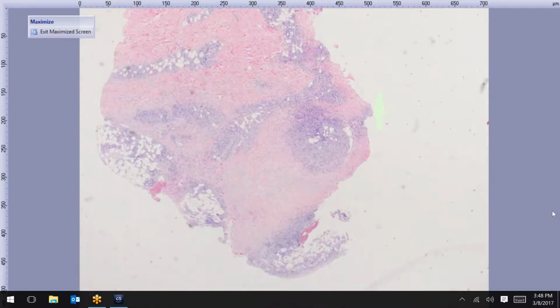Oh, do you usually see so much connection with the epidermis? I would say you can, but not typically. It just depends on if you catch a hair follicle. You know, this is a follicular tumor, so hair follicles sort of connect with the epidermis, but I would probably say more often than not, I don't see that connection.